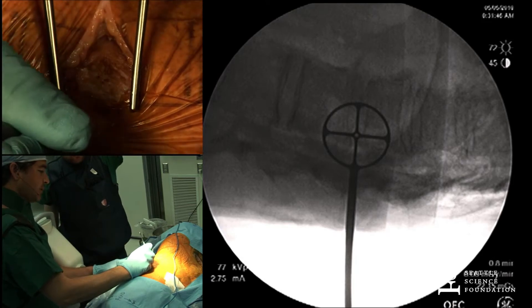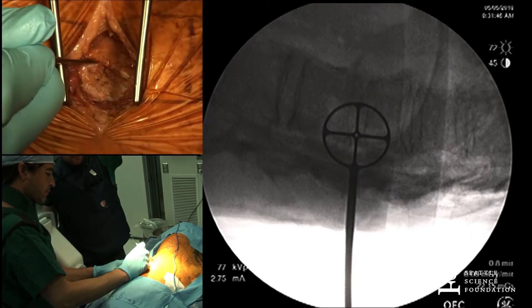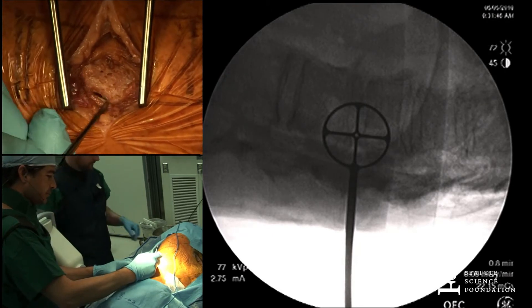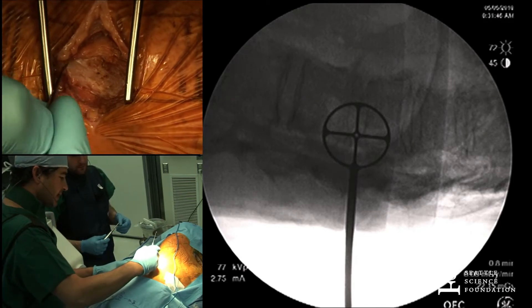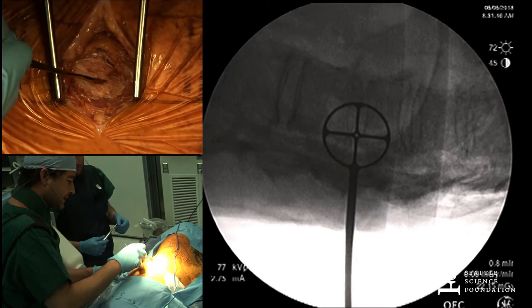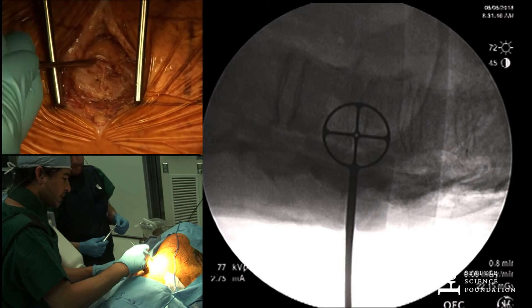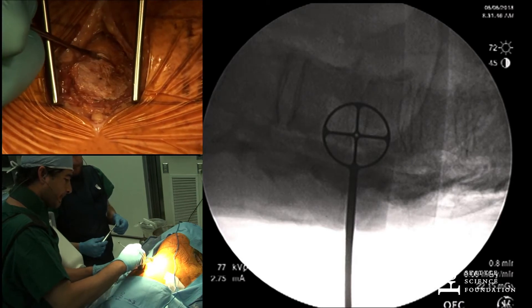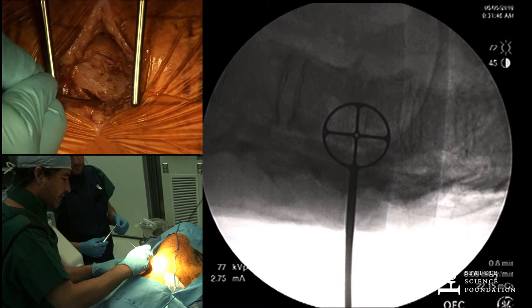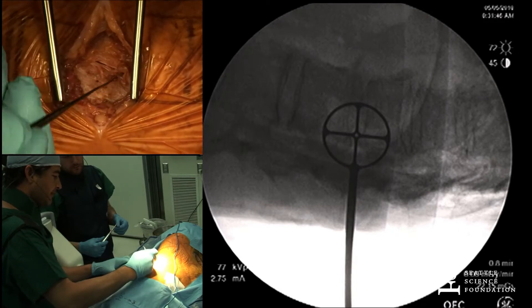You have the intercostal nerve and artery, so we carefully dissect all this off. As Juan pointed out, you really want to try to stay out of the chest. In a cadaver, sometimes it's pretty stuck and very thin. You can see here's the rib, and you start to see a shiny structure right there — you start to see the pleura. During this approach, I would spend a little extra time dissecting both above and below the rib.